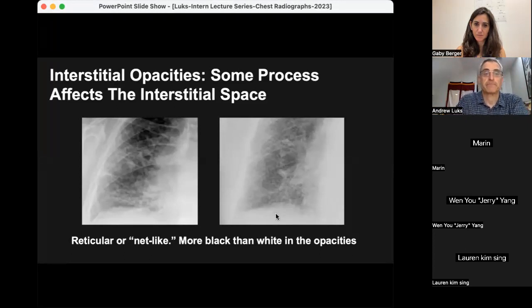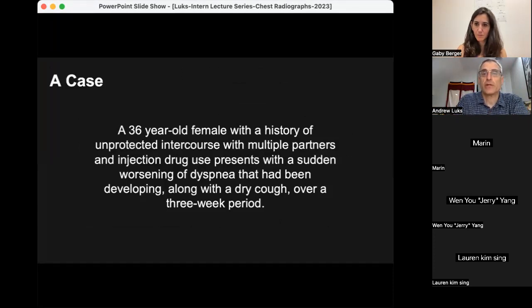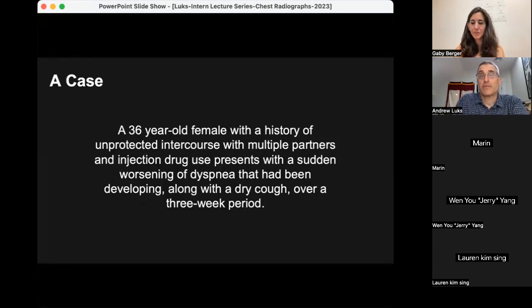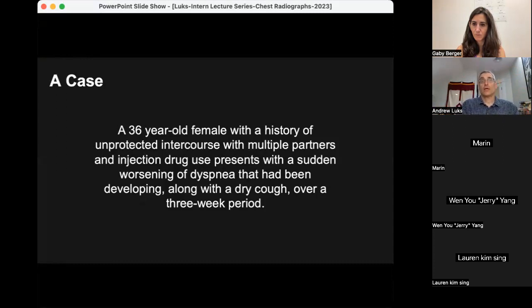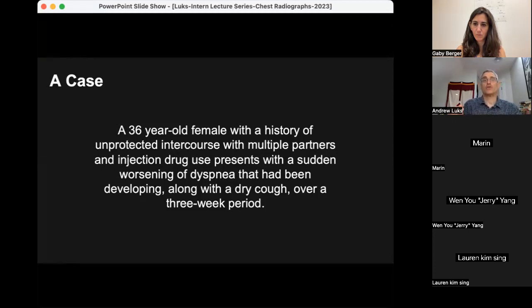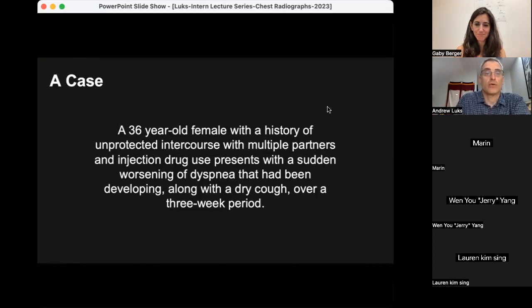A question in the chat: do chest radiographs usually come with a lateral film? It depends on the patient's status. For portable films on patients too ill to go to radiology — such as those decompensating on acute care or in the ICU — you'll only get an AP view with no lateral. You get lateral radiographs when you order PA and lateral in clinic, or in the ED or urgent care when patients are not so critically ill. Laterals are great for trying to localize retrocardiac opacities, but quite often you have to make that call on just an AP film.